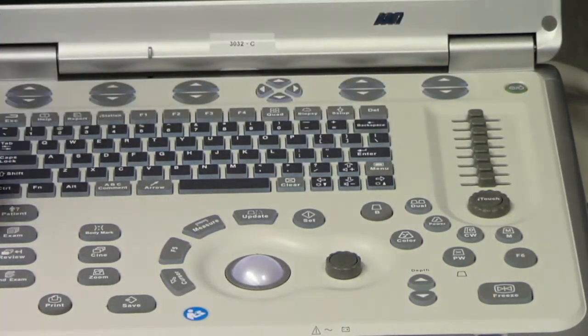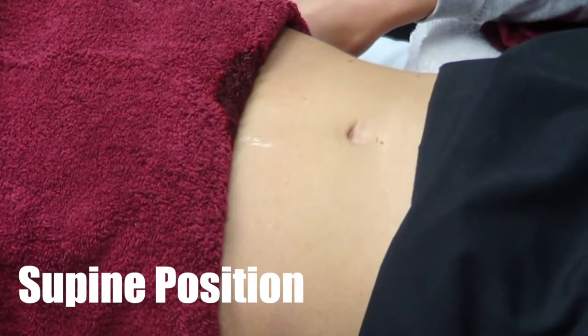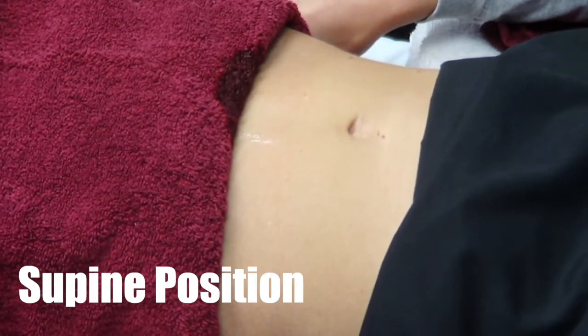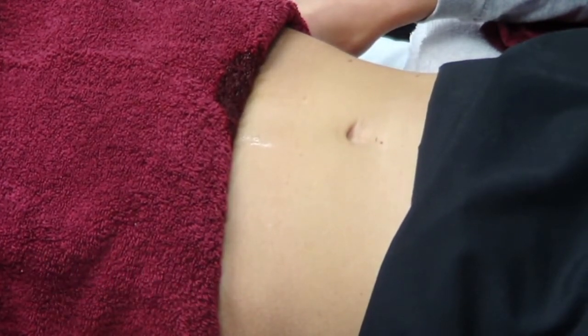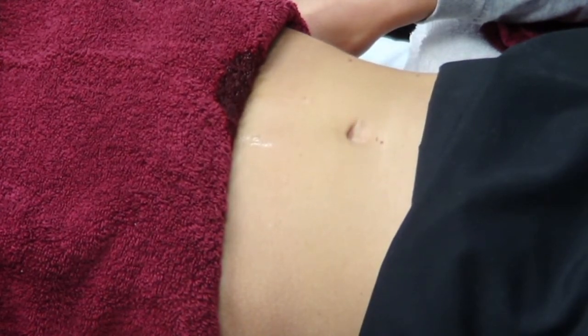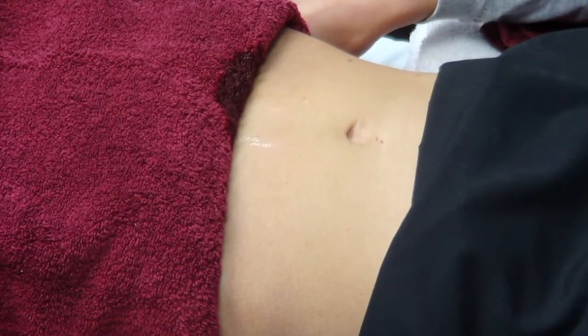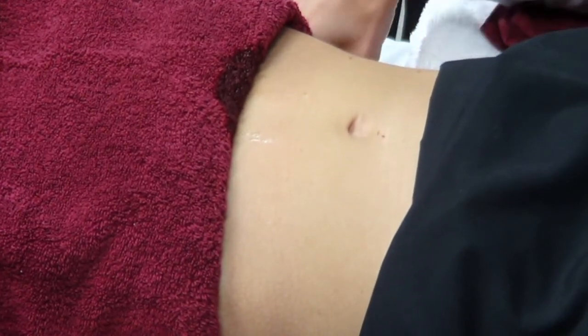Okay, so let's talk about the patient position. If we move over here to our patient, you'll see that she is lying down in a supine position. And so that's the position that you'll want your patient in normally. Only if you're in some sort of situation where the patient is unable to lie down flat, you'll just have to make adjustments to accommodate the patient. But otherwise, you just want them supine.